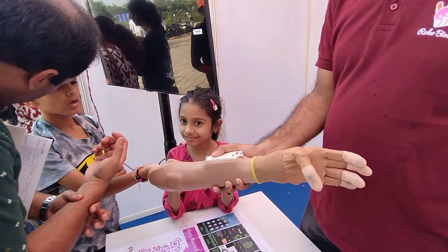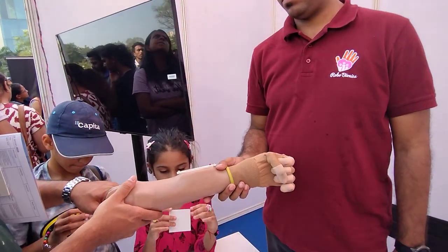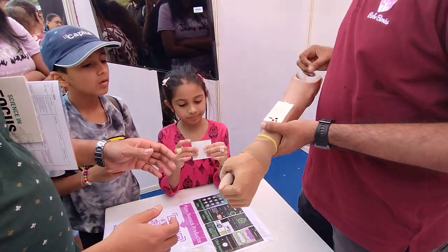What is the option to this? The option to this is a hand which doesn't work. Mechanical one. Does mechanical work mechanically? How does that work? So it works in a wire mechanism, wherein using wire you trigger the hand. Okay. So if something is obstructing it, if you show your hand.